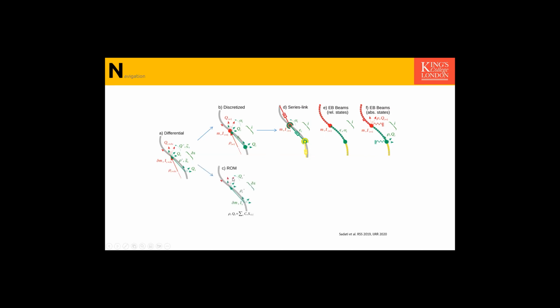These are discretized models. We can approach a continuous model, which is called the modal approach. Well, I like to call it reduced order modeling approach, but the community knows it better as modal approach. In a modal approach, you assume the backbone shape to have a specific representation. It's very similar to interpolation or curve fitting with polynomials or splines or things like that. So a way of doing that is having these splines or polynomials as the shape of the robot, so that gives you the kinematics of the system. Then you can mix it with any conservation law or constitutive law later.